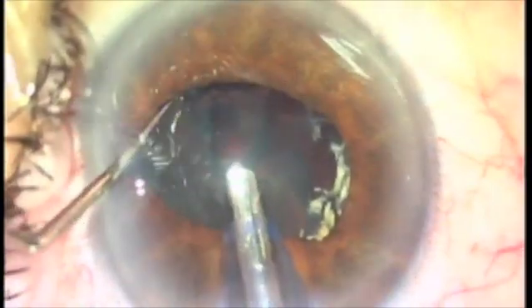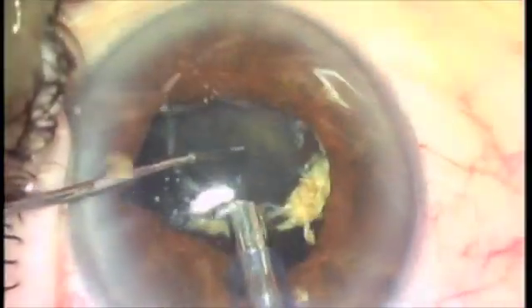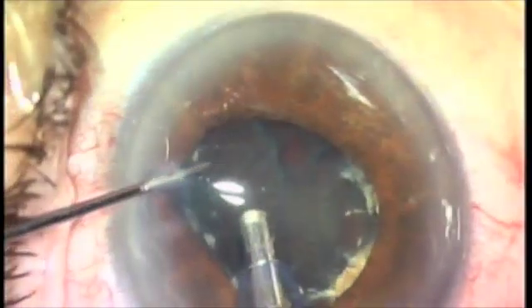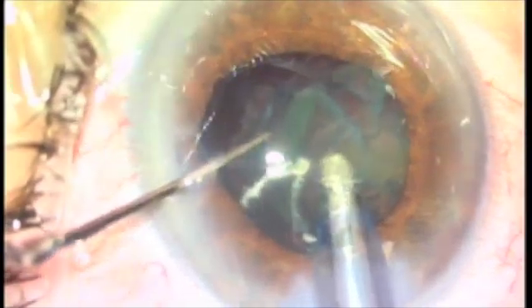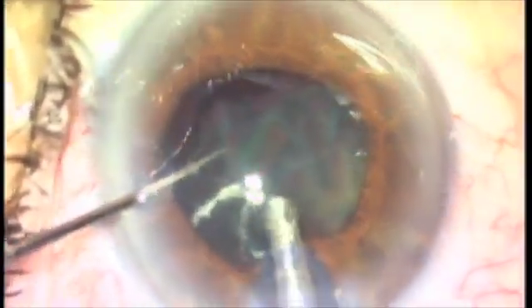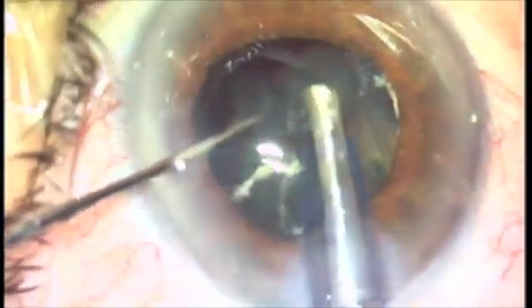This really gives you terrific control over this procedure and takes away the necessity for iris hooks, and really reduces the stress on the surgeon. Take your time and nibble away the nucleus right in the center of the pupil.